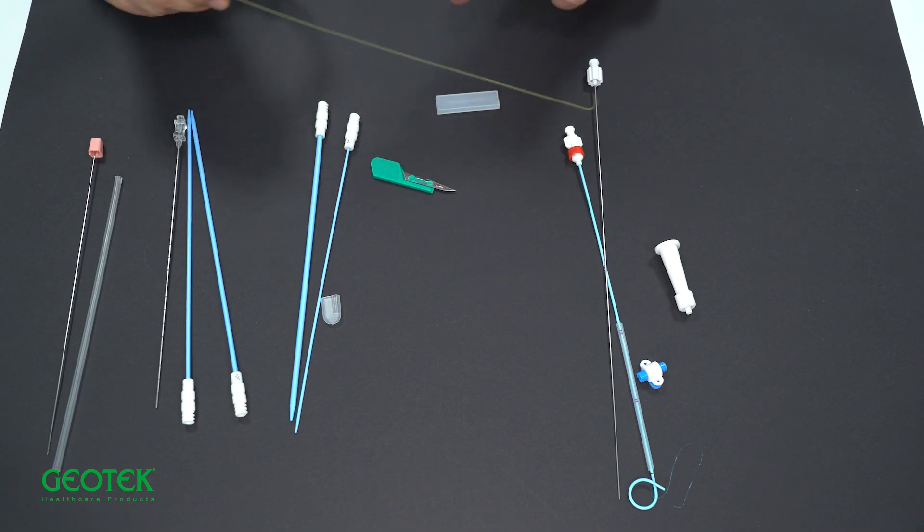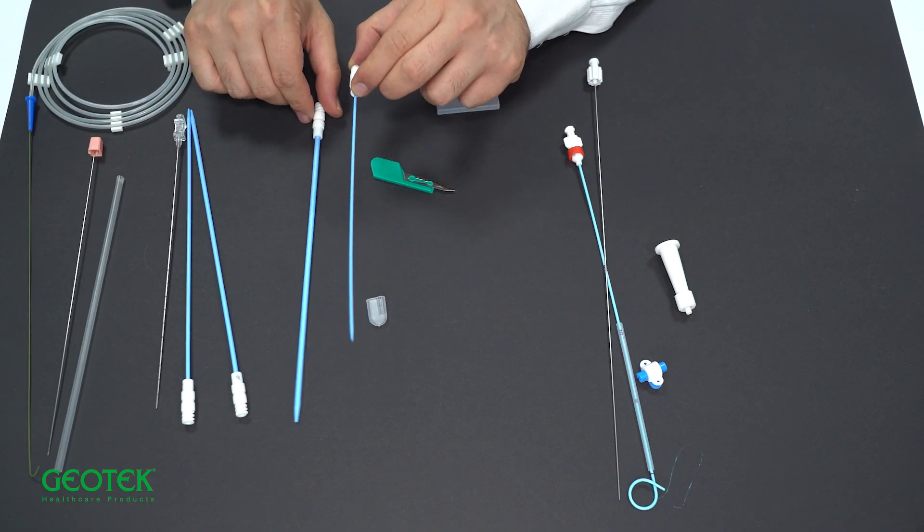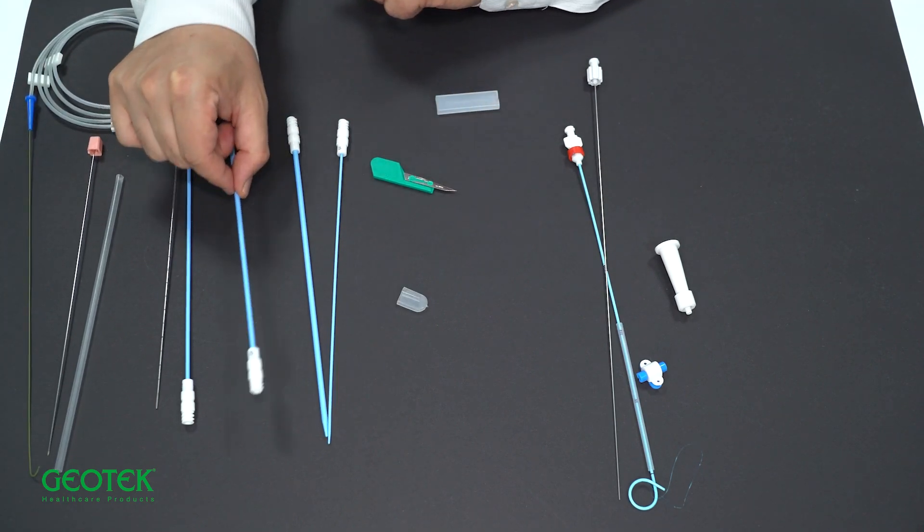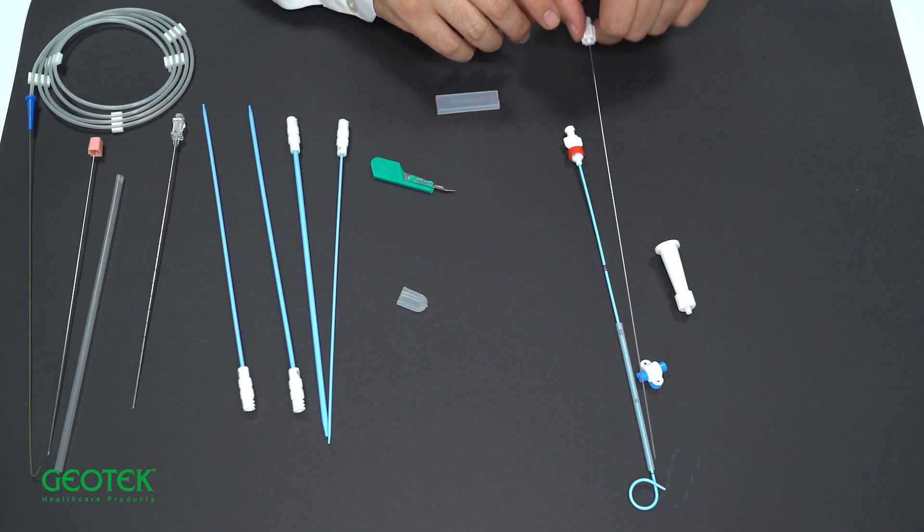After this wire is sent, the needle is removed and the percutaneous nephrostomy tract is dilated with dilators over the wire.